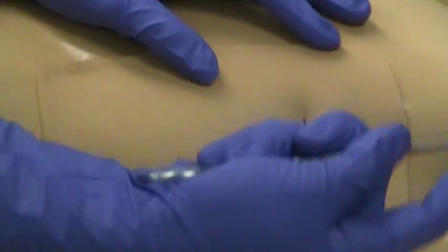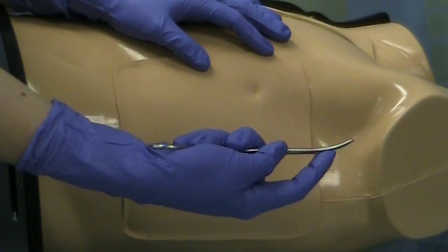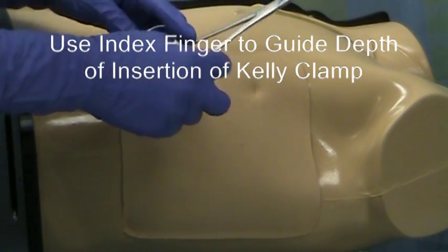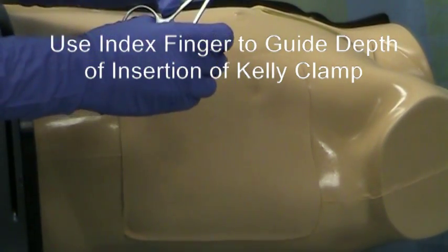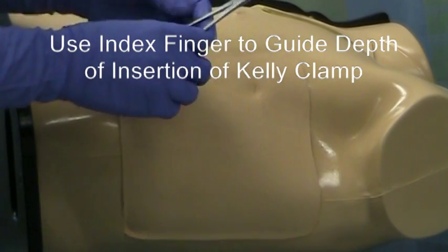Now notice how I'm holding the Kelly clamp. I use my index finger to help control the depth I'm going to insert my Kelly clamp into the patient so that I'm not jabbing all the way. If I hold it all the way back here, I could conceivably insert this Kelly clamp all the way that distance and hit some very important structures that the patient and I really don't want to hit.